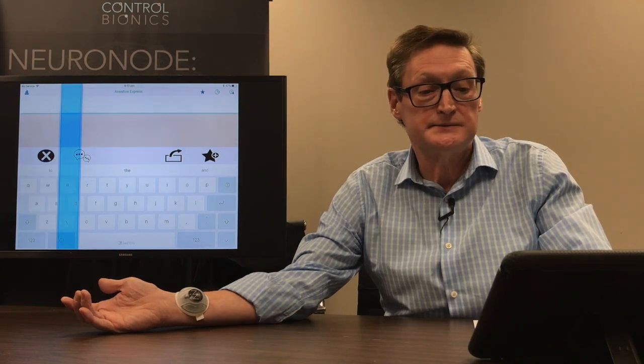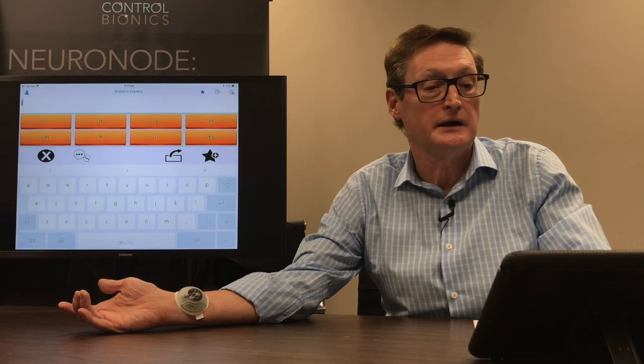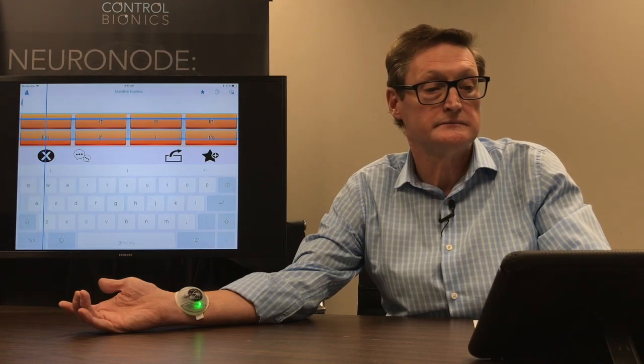So once you can do that, you can then move on to more advanced activities such as speech generation or even ultimately environmental controls. So let's have a look at how that works. And I'll just go back here. So now I can access a speech generating package. I'll just stay at the end. And I can begin speaking. For example, I can cross over and highlight that letter I. I can then begin to speak.